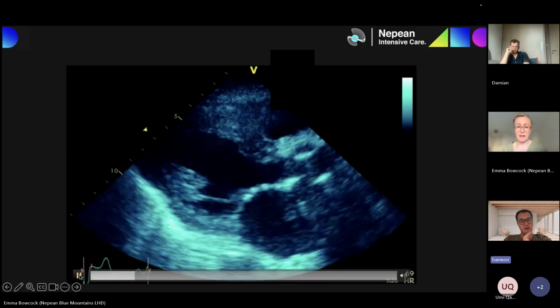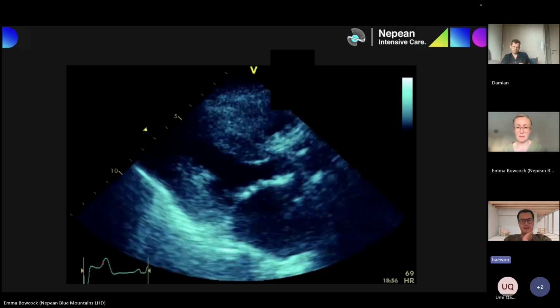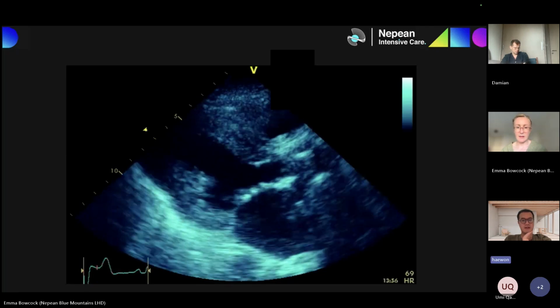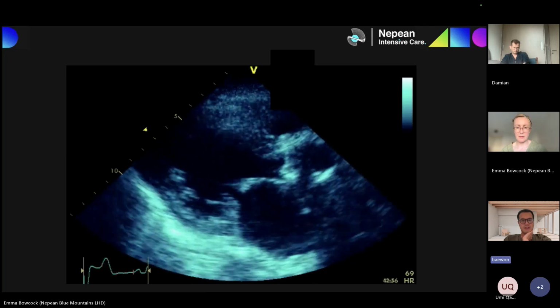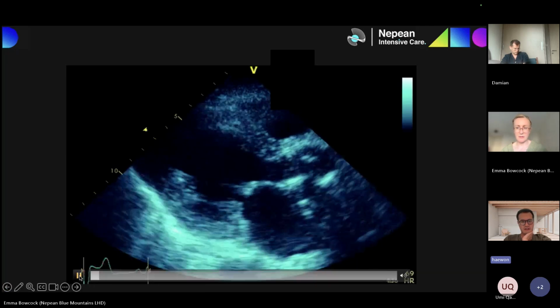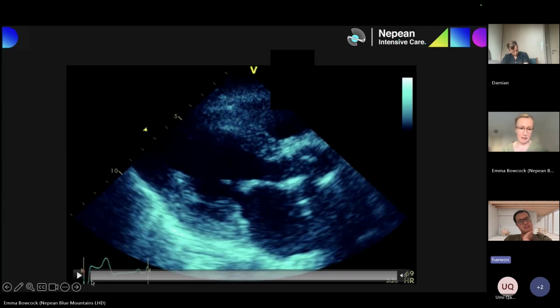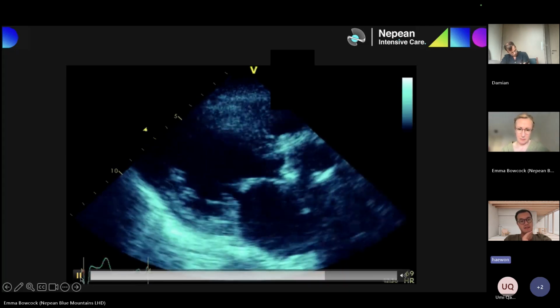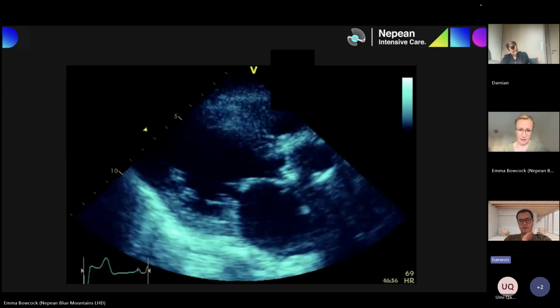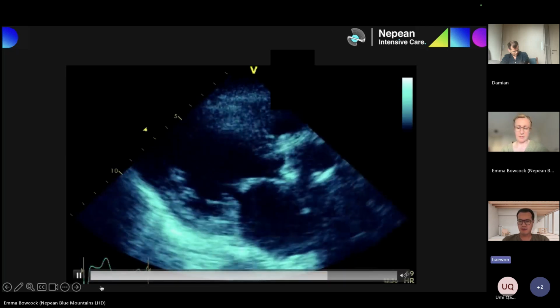So, parasternal long axis view. Going through systematically, the LV function appears hyperdynamic. Both the anteroseptum and infralateral walls are contracting normally on this view. LV size does not look significantly enlarged, but I like to confirm it with measurements. RV, again, not much abnormality there.